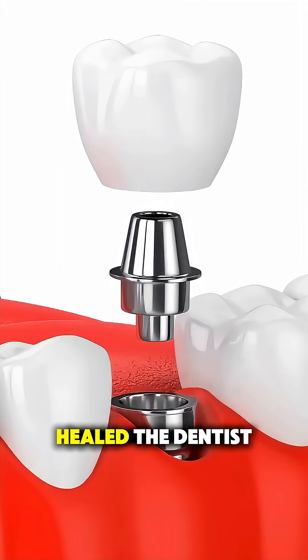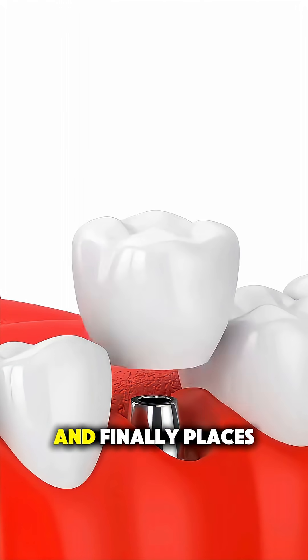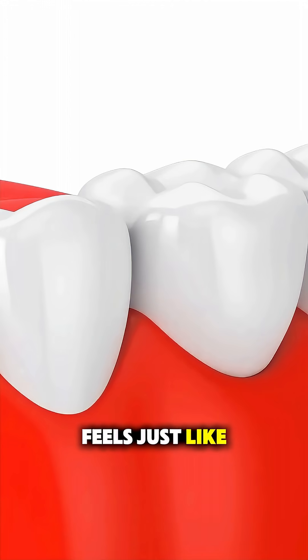Once it's fully healed, the dentist attaches an abutment, which is like a connector piece, and finally places a custom-made crown that looks and feels just like a natural tooth.